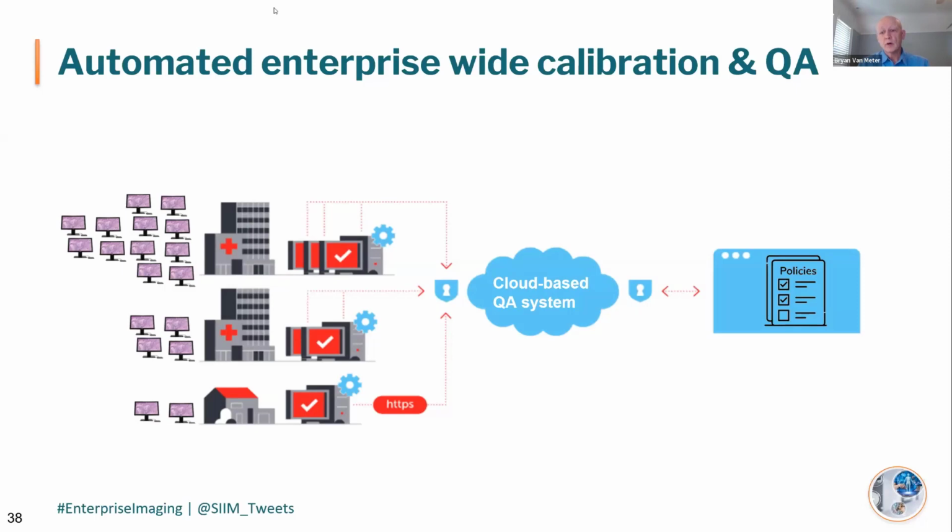That is important. What I also personally think is important, as you point out, as a consumer as well, is that when a physician is making a diagnosis, there is a record that the device is in calibration to what's expected for them to make that diagnosis. There is a record associated, and it's held in these QA systems that are on board.